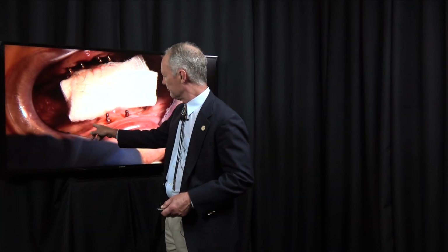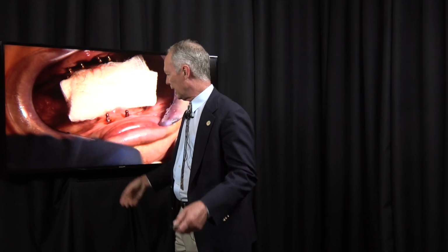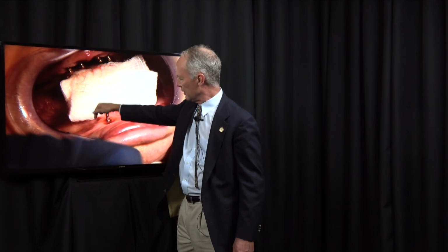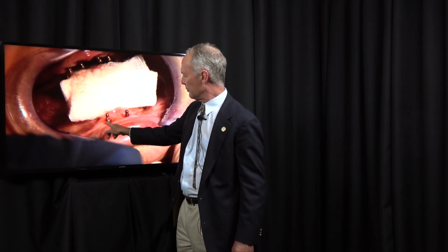Then take your digital measuring application and measure from here to the mental foramen on that periapical radiograph, and just be sure you're 5 to 7 millimeters mesial to the mental nerve. Now, as you get closer to the mental nerve, I try to move the implant just a little bit lingually, not into the non-keratinized gingiva, but all the action is out here on the facial, unless the ridge is resorbed enough that the mental foramen is pretty much on the top of the ridge. So bottom line, measure digitally from this implant, place these two implants, then measure from this implant to the mental nerve and stay 5 to 7 millimeters mesial to the mental nerve.